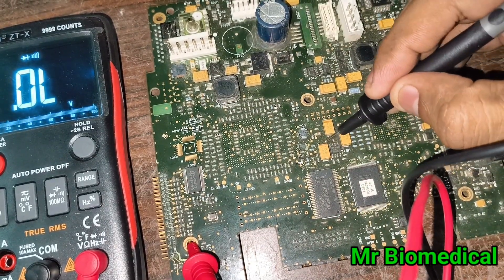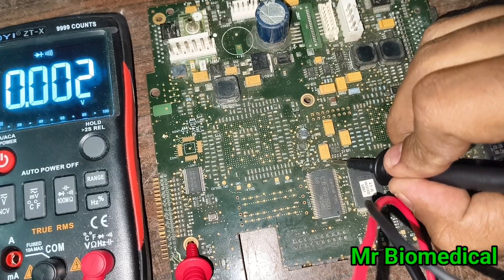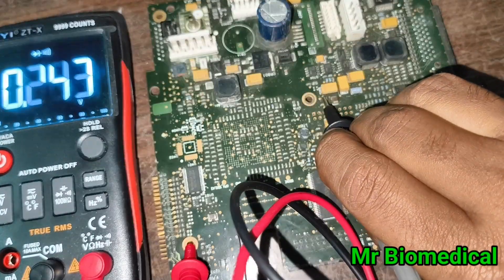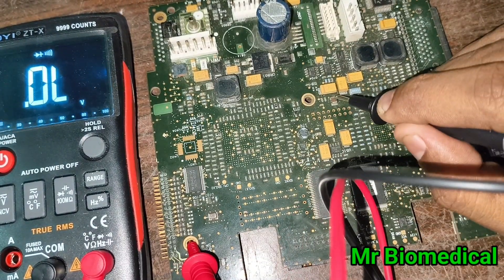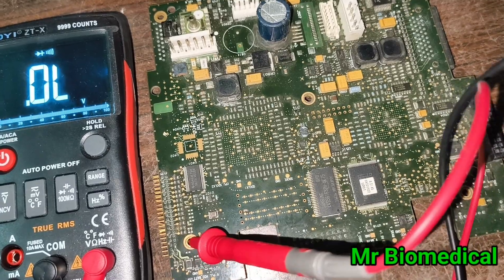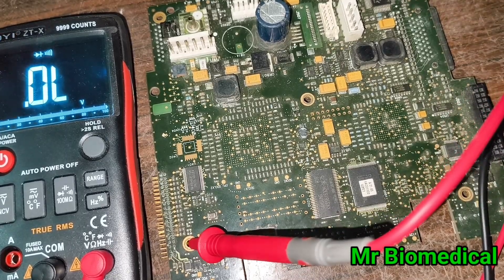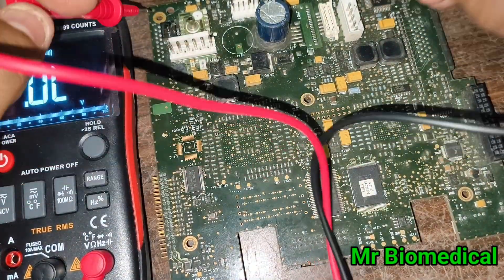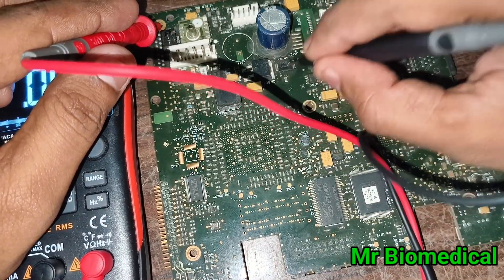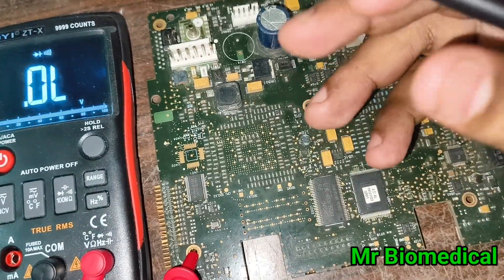Now I'll do random capacitor checking. This is the positive line — reading 0.556, that's good. This is the negative section — absolutely fine. No short here, no short here. If an SMT board has multiple different grounds, you have to move the red probe to each ground pin and check component similarities. Here the ground pins are the same so I don't need to worry about it.